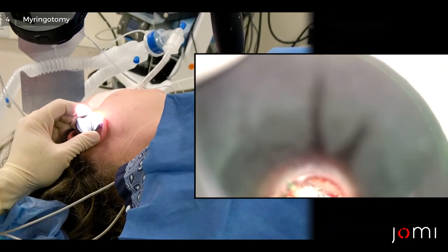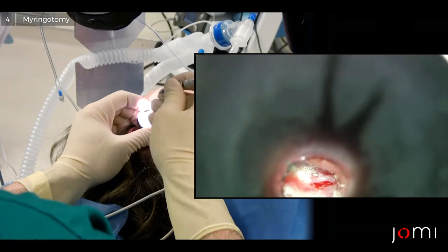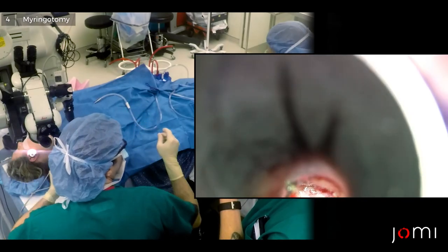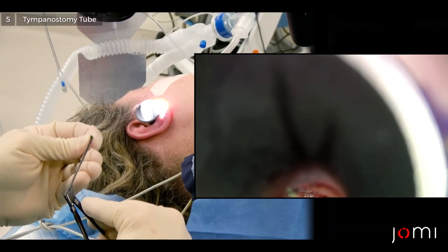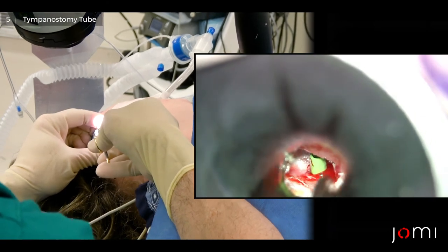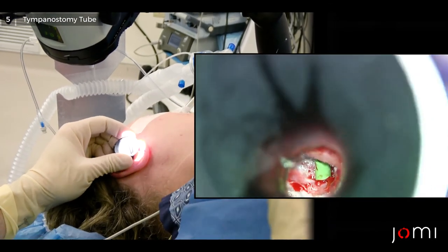Take a small suction — I don't think there's an effusion. Can you put about a 20 suction on? It's pretty dry in there; there's a nicely aerated middle ear space. Having this tube in there will help keep it aerated and keep the eardrum from retracting again.